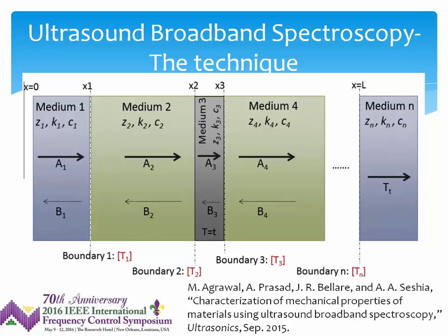So this is essentially the simplest formulation of a model that involves the sample of interest sandwiched between media through which you've got propagation of plane waves, in this case just one-dimensional plane waves, with a number of assumptions built in, including the fact that these are lossless media, for instance.